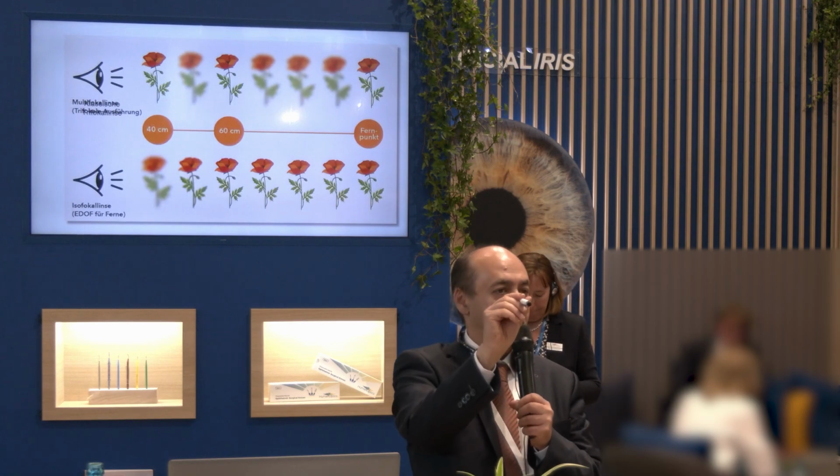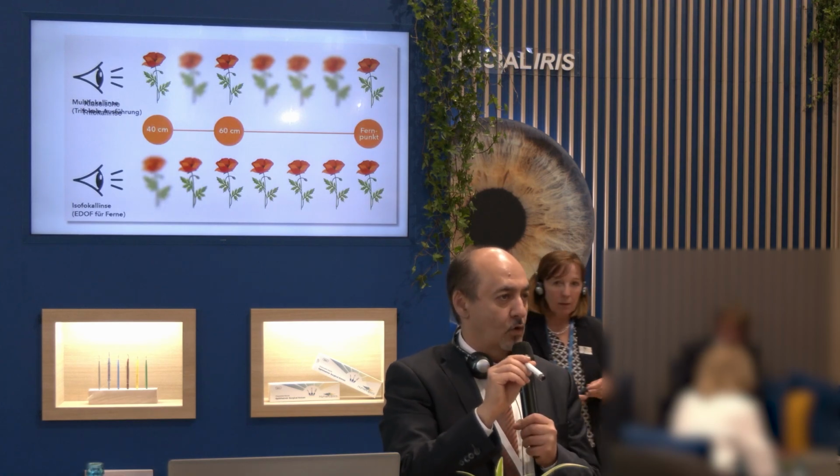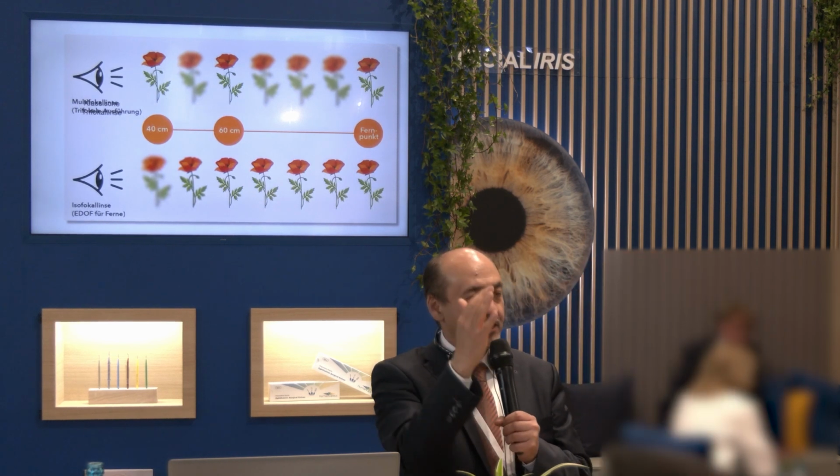The retina always looks from the front, creating what is known as pseudo-accommodation. This is how an isofocal lens works, which typically achieves this through changes in sphericity. The more spherical an optic is, the less precise it becomes, and we utilize this here. By making an optic more spherical, it makes light scattering easier. But it improves pseudo-accommodation because it allows us to image more points.